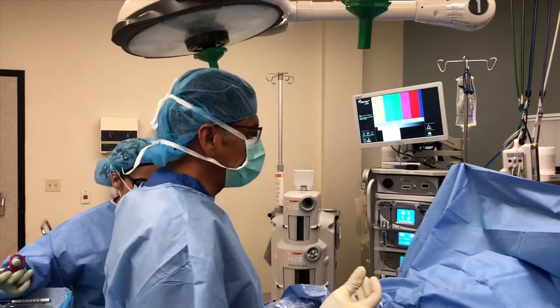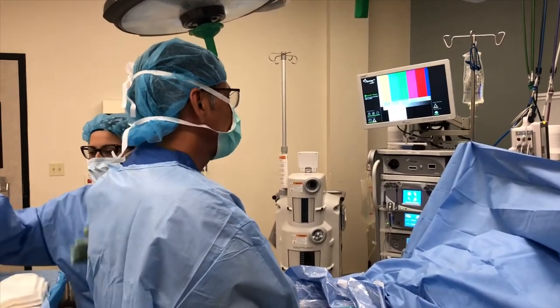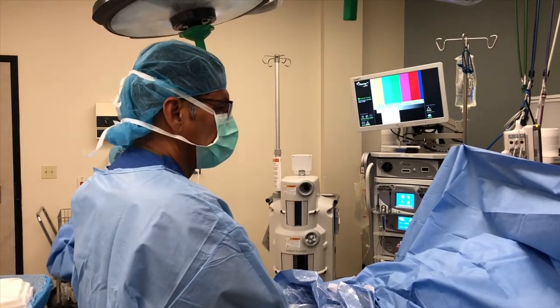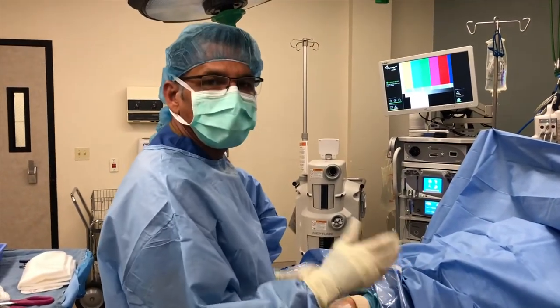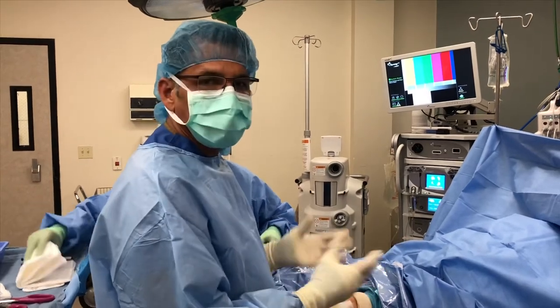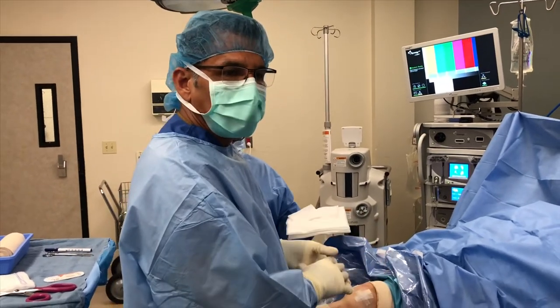So we just finished doing a simple knee scope under local anesthesia. We're done. We're putting dressings on. Can I ask you a question, sir? How do you feel? I can't believe I just had knee surgery. You can't believe you just had knee surgery? It's amazing. Actually, when it's done right, people can be very comfortable, and it's an option for people that just don't want to have anesthesia, and they're wide awake. There are a lot of nuances and details that allow it to be done right.